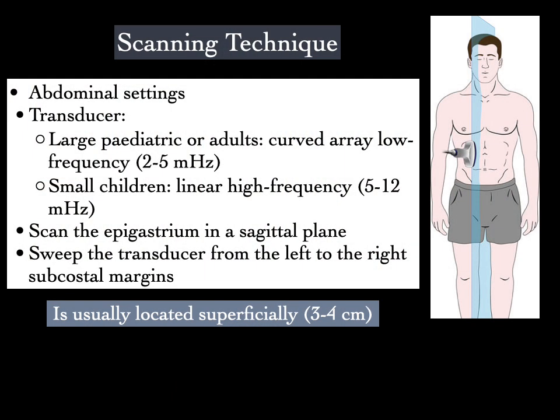Now what kind of transducer setting do we need? Normally in most adults we require a curved transducer, whereas in children you probably can manage with a linear transducer as well, and it may give you a very high resolution picture.